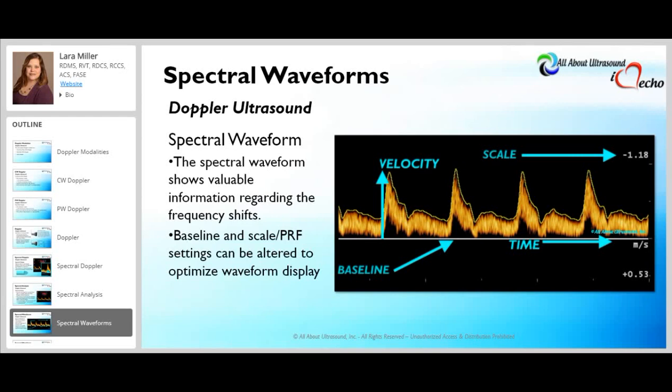However, the spectral waveform display gives us very valuable information regarding the frequency shifts, so it's helpful in diagnostic ultrasound. With the spectral waveform display, we're able to see and actually visualize the baseline, the scale, and PRF settings, as well as the time and the velocity information.